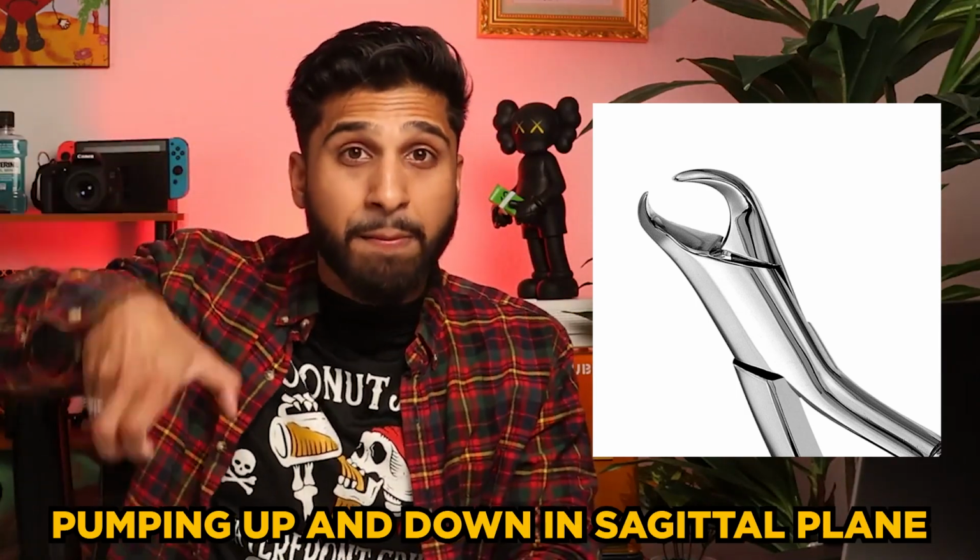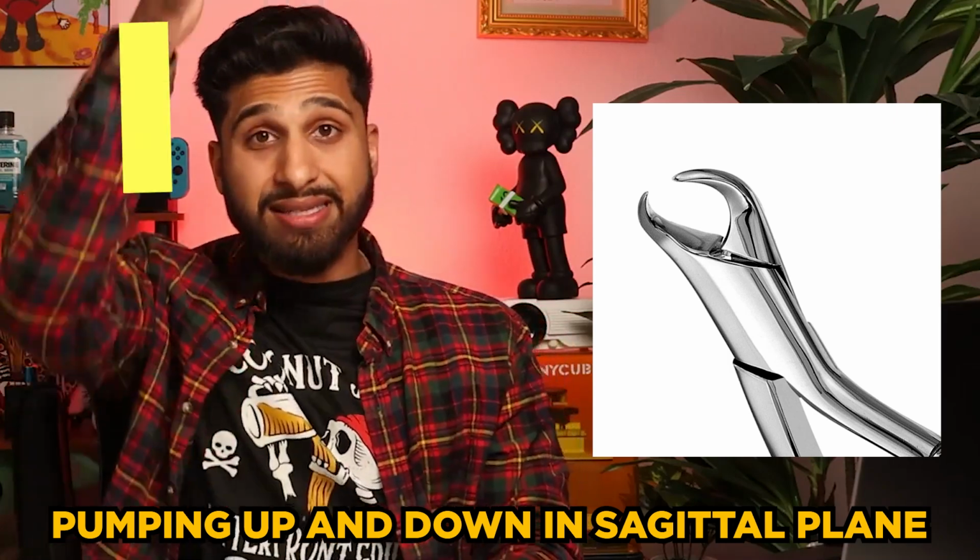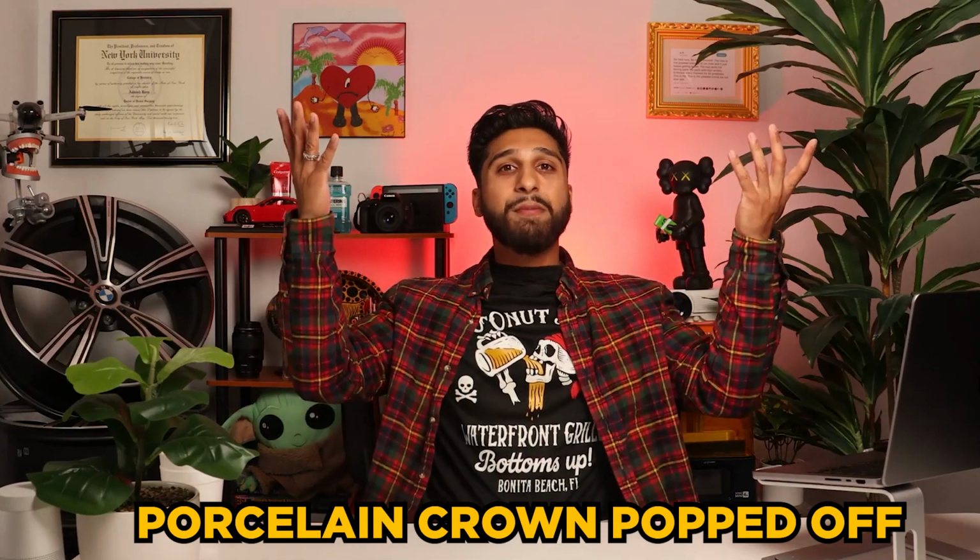So the forceps I'm using are the 23 forceps, the holy grail of lower molar extraction tools, the cow horn. This is a fantastic tool because it really digs its beaks into the furcation, and with a gentle pumping motion up and down in the sagittal plane, it facilitates a smooth removal by lifting the tooth just out of the socket gently. So as I proceeded to pump up and down, the porcelain crown pops off.